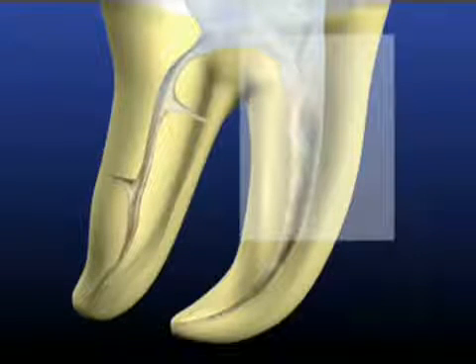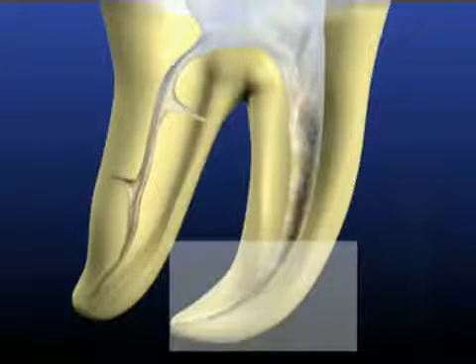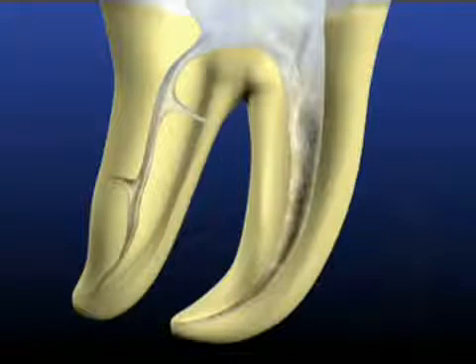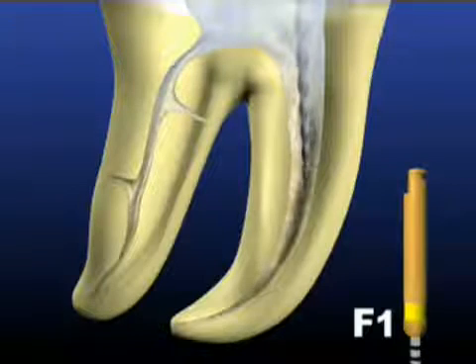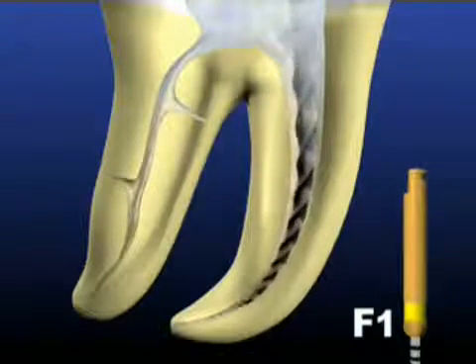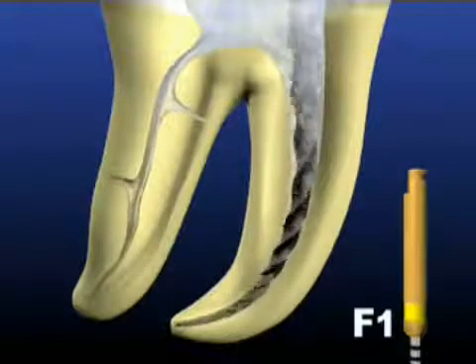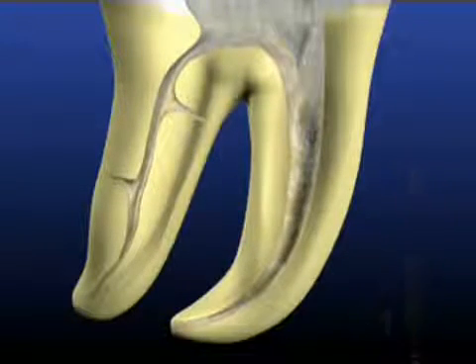Now that the coronal two-thirds of the canal has been optimally prepared, the apical one-third can be finished. The finishing file number one has a yellow ring on its handle, designating that its tip diameter is equivalent to a size 20 file. With the canal flooded with irrigant, carefully take the F1 to the working length. The finishing file's decreasing taper feature concentrates the shaping action in the apical region and minimizes coronal shaping.